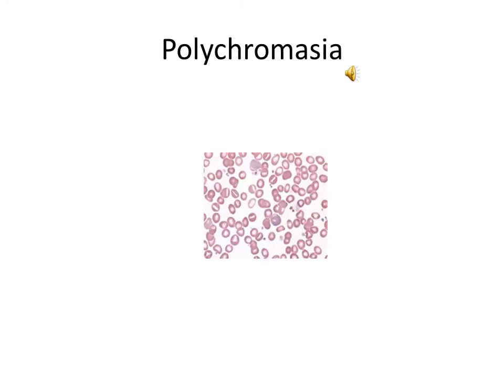In this slide, you should see several red blood cells that are slightly larger and have a different color than the other red blood cells. Instead of that pinkish color, they're a gray-blue. Those are polychromatophilic red blood cells. And this picture is of some cells that have polychromasia. And we grade them, and you can look at how the grading is in your chapter.